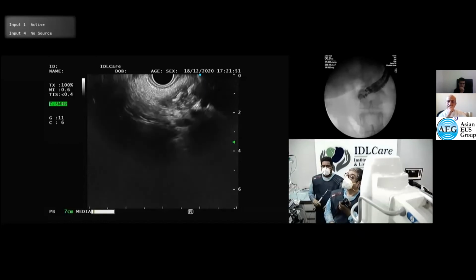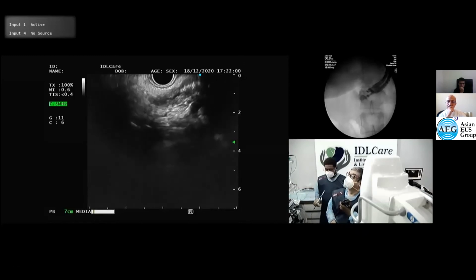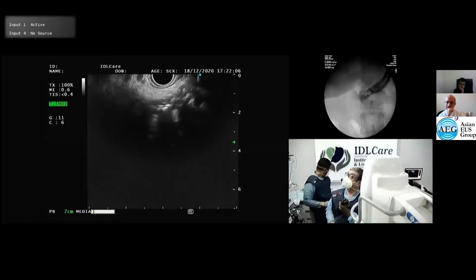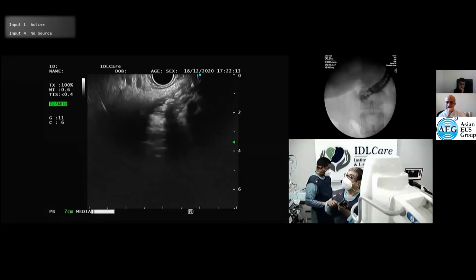Yeah, Yogesh, your idea is right, sometimes I think we should maybe do a general anesthesia. She is very unhappy. She's moving, she's hiccuping. It can sometimes be risky in such an advanced situation to puncture at this time if she's moving a lot. Needle.